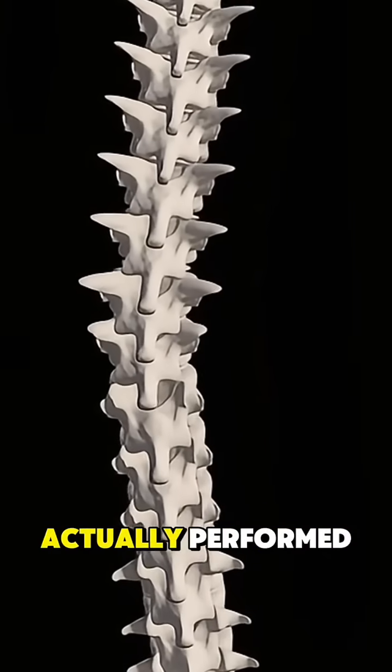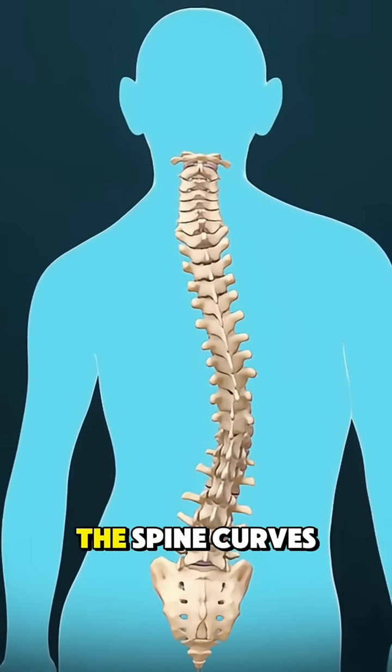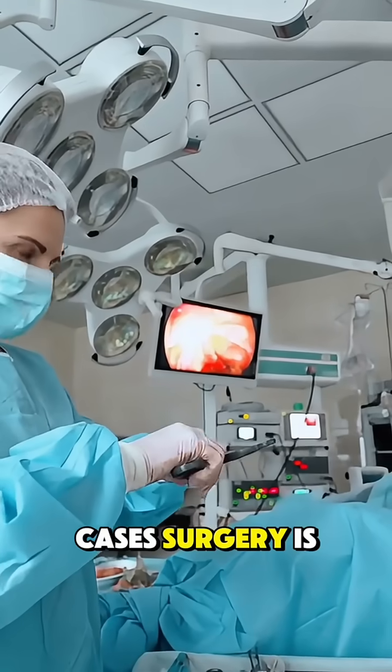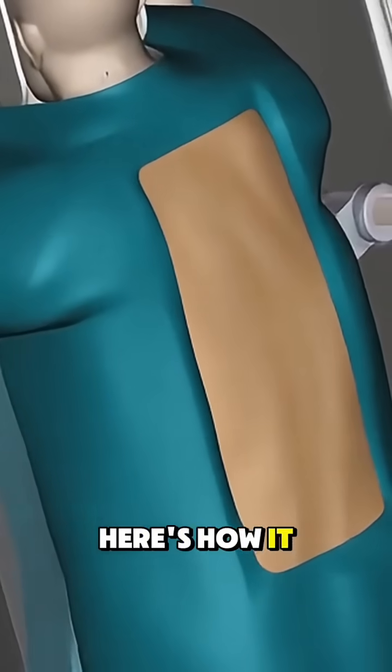Ever wondered how scoliosis surgery is actually performed? Let me break it down in a way that makes sense. Scoliosis is when the spine curves sideways, and in severe cases, surgery is needed to straighten it. The most common type is called spinal fusion. Here's how it works.